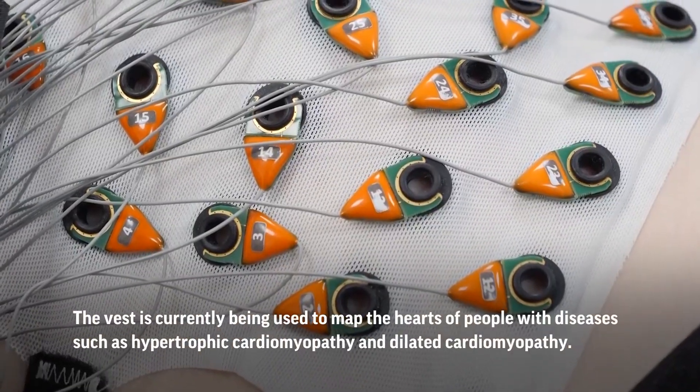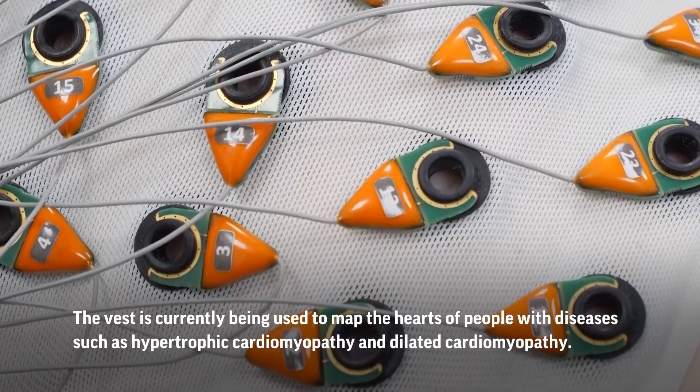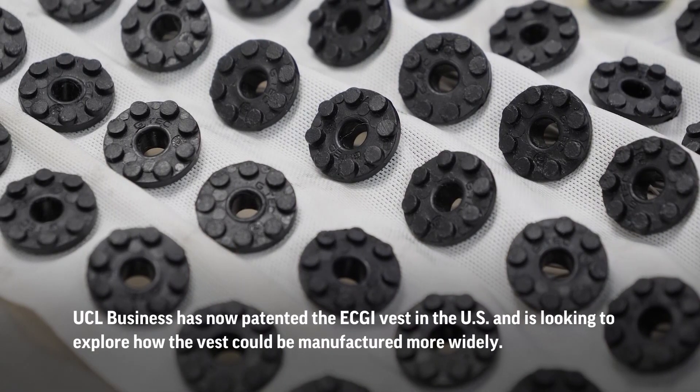And these here are the gold electrode clips, which then connect to the device. As I mentioned before, we can then marry up the electrical activity and the functional activity of the heart.